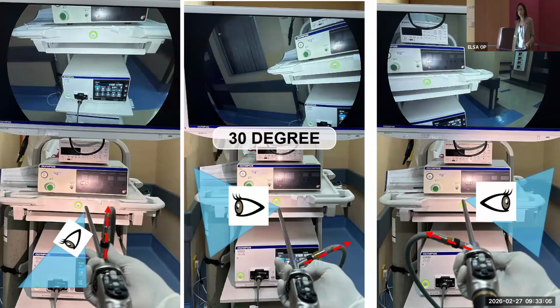So this is what we use for laparoscopic cholecystectomy, like to see the posterior and the anterior side. And sometimes in ventral hernias, when we want to see the anterior side as well.